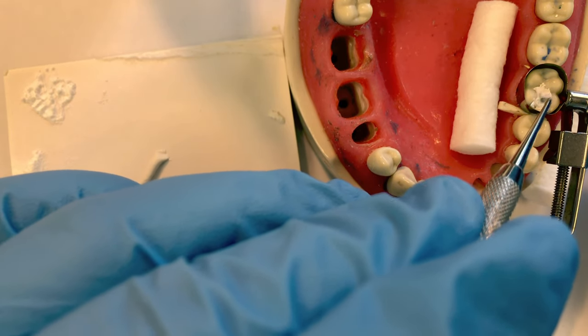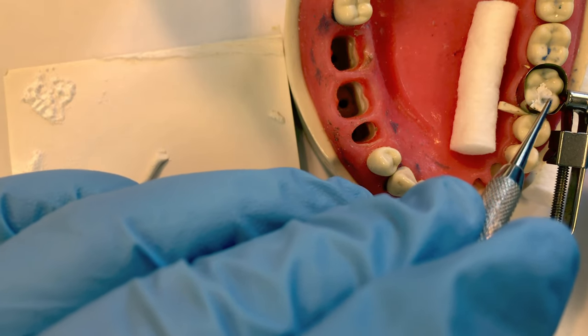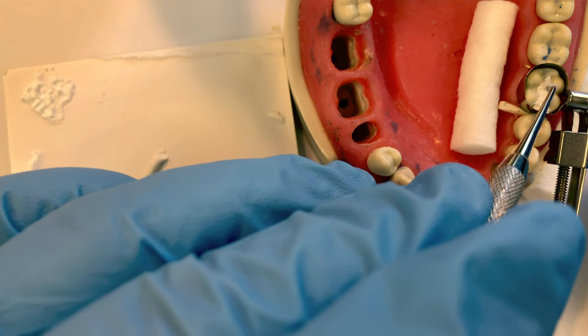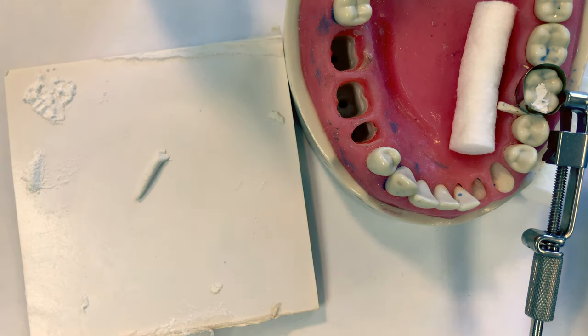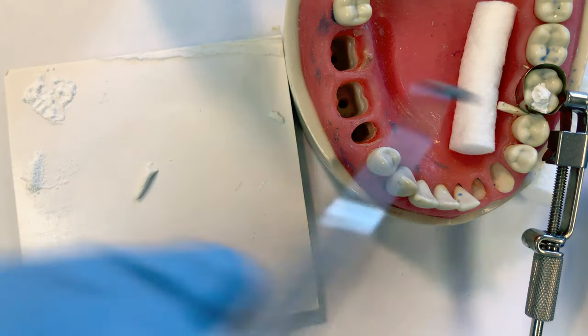We have an initial set time of five minutes that starts from your mixing time. So if it takes you a minute to mix and about a minute or so to pack it into the tooth, you're then looking at about a three-minute initial set time remaining.